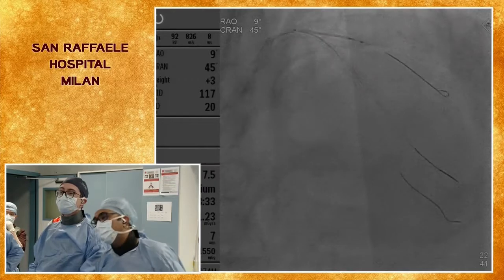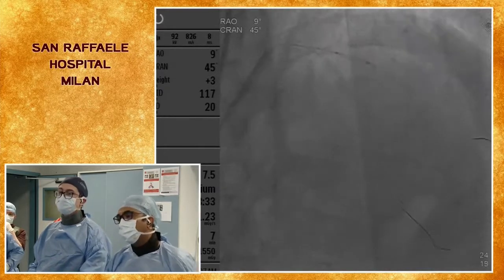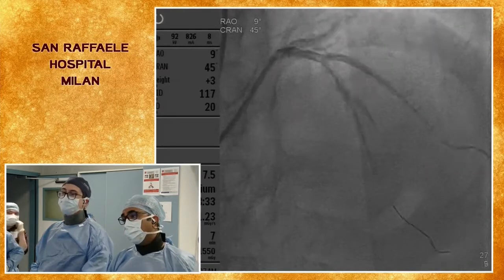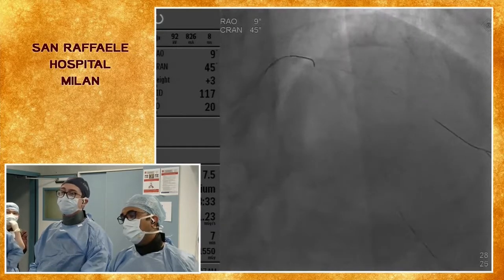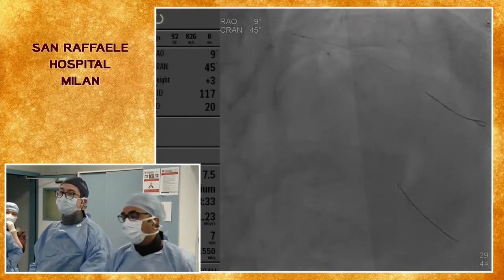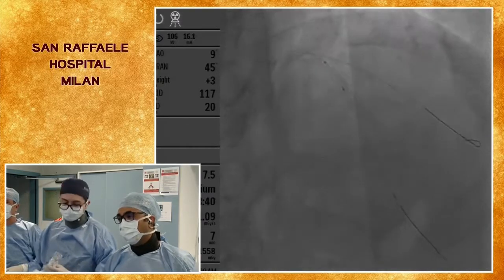We then put an Onyx 2.5 by 26 millimeter stent from the LAD to the diagonal, the first diagonal. We post-dilated that with 3.0 in the diagonal. And then we did a POT with 3.5. That's the result after the POT. Next. We then repassed the struts, using the distal rewiring technique. And now we're in the process of doing a kissing on this proximal bifurcation. And then I would love to have your opinion, Eve, on what you would do for the LAD.